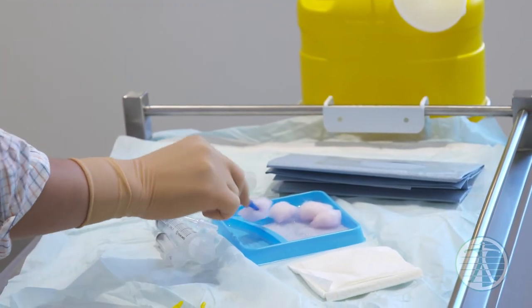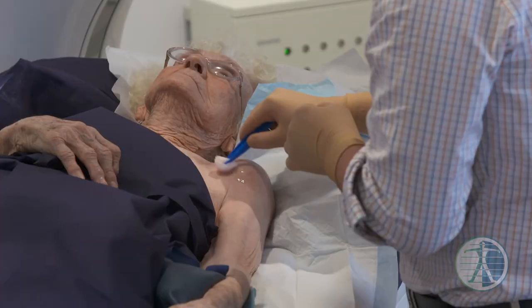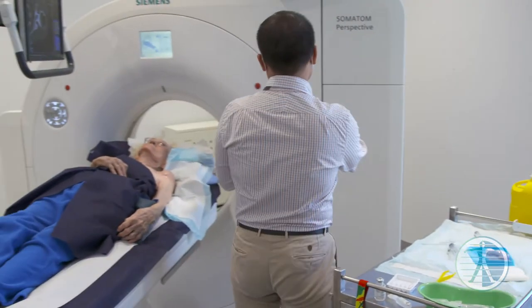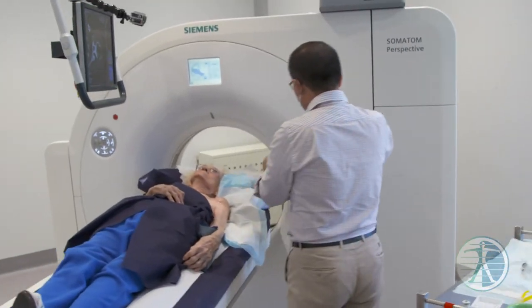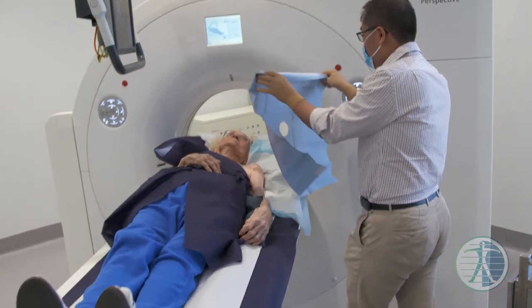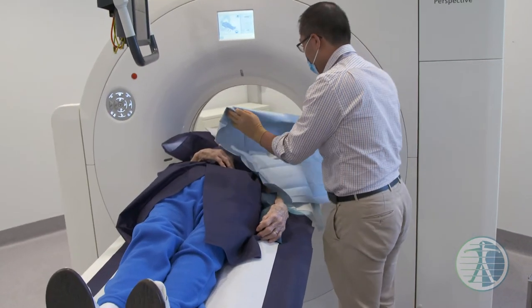We will sterilize the skin and give the patient local anesthetics. Joy, I'm going to put a drape — just a cover — over this way.